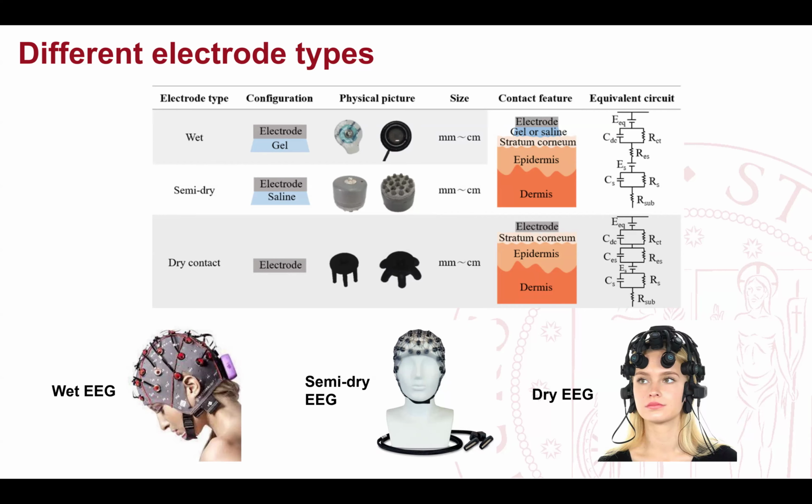So beware, because I was at another university in Italy, and they said, oh, help us. I had done a similar workshop on another system, and they said, okay, help us put on the cap. I was not seeing any signal. I checked the cup and it was full white. They never cleaned it. I said, okay, you have to throw it away. And they lost 50,000 euros like this.